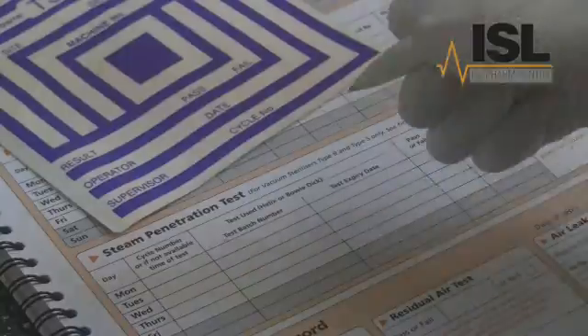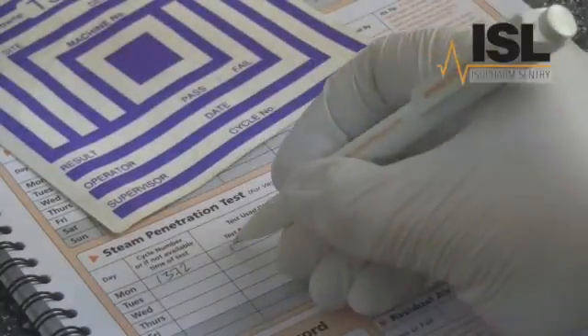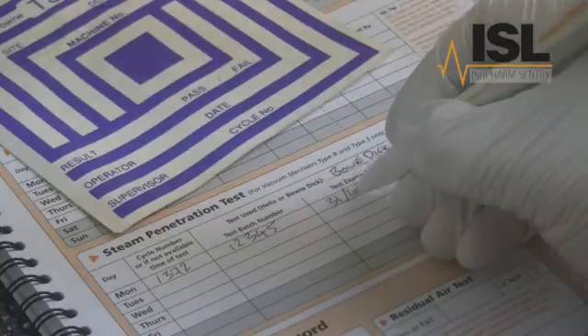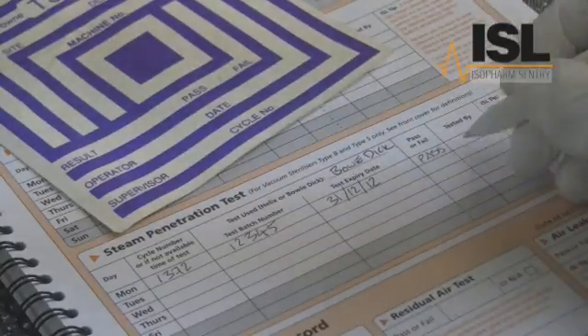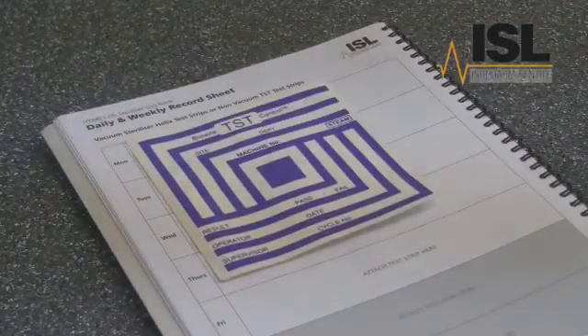If the test does fail, you can contact Isofarm Sentry for further advice on how to proceed. After the test, remember to complete the test record in your machine logbook. You should also attach the test sheet in the logbook as further evidence of test results.